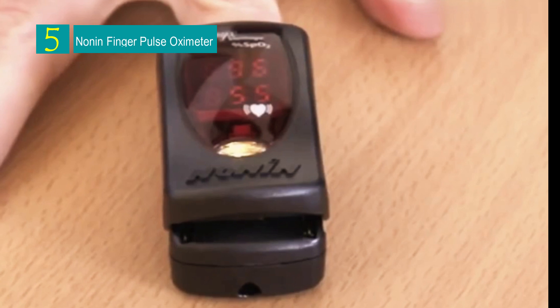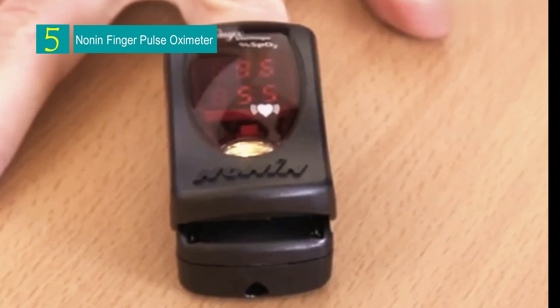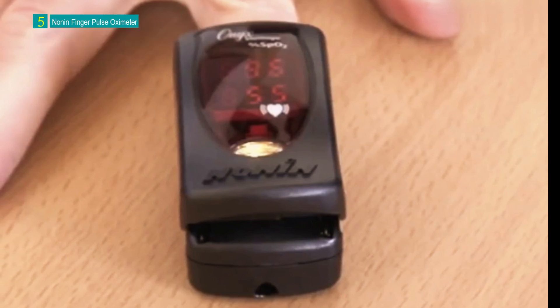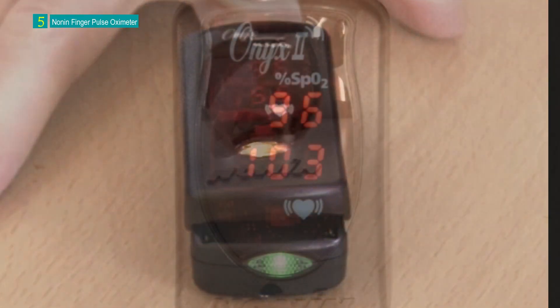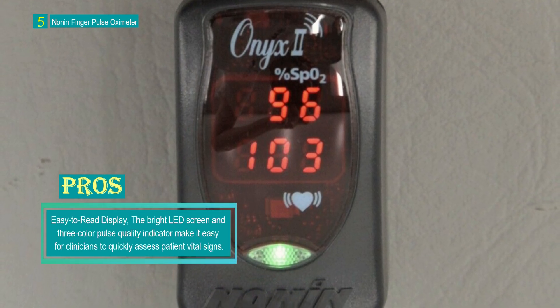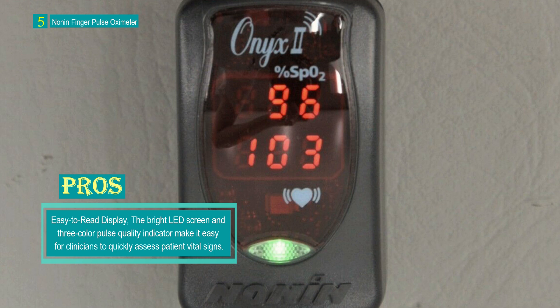Number 5: the Nonin Finger Pulse Oximeter. The Curaplex Nonin Onyx Vantage 9590 Finger Pulse Oximeter is a versatile medical device designed for clinicians to perform fast and accurate spot checks of oxygen saturation (SpO2) and pulse rate in both pediatric and adult patients.